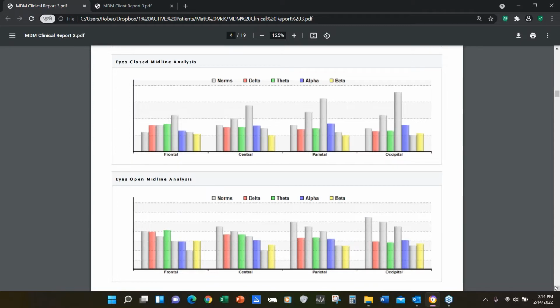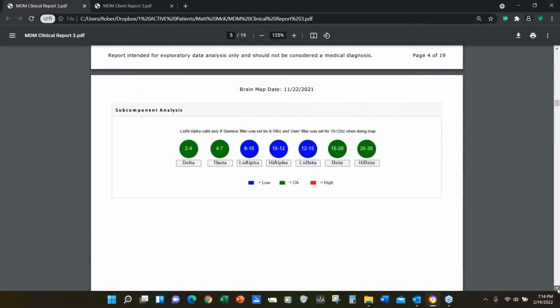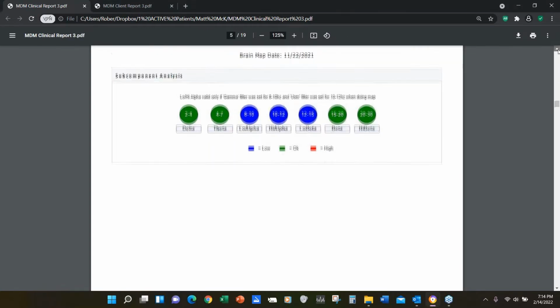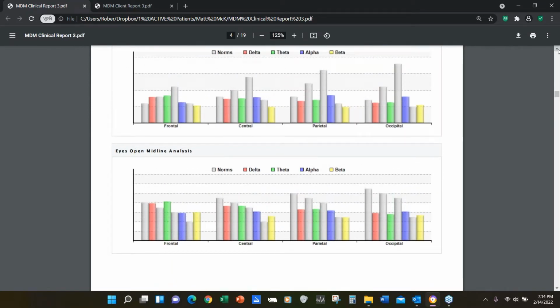Now, one second. Here's what I want, after you describe this, I think what would be really helpful would be to go back and talk a little bit about how you talk with people about what you just described. Yeah, exactly. I'm just going over what the parts of the map are, and then we're going to go to the very top again, and I'm going to let you start out, kind of reviewing it all, and let you and Richard chime in.